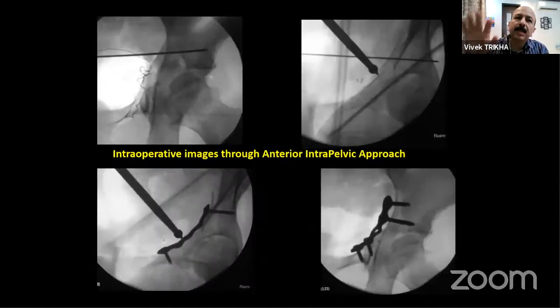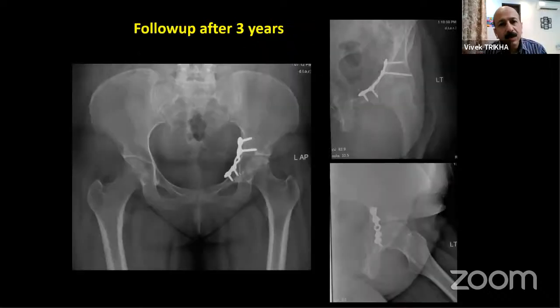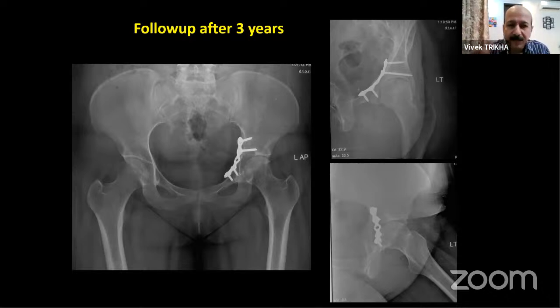So what you do is you take this case intrapelvic, start your stoppa with these intrapelvic approaches, push the quadrilateral plate and the column back with small plates. These supra-acetabular screws, the two screws, are the key stabilizing elements, and you get a fixation, pushing back the quadrilateral plate and the column. And she was fairly good even now, after 8 to 9 years of follow-up that I have. It was one of my initial cases when I started in 2013 or so.